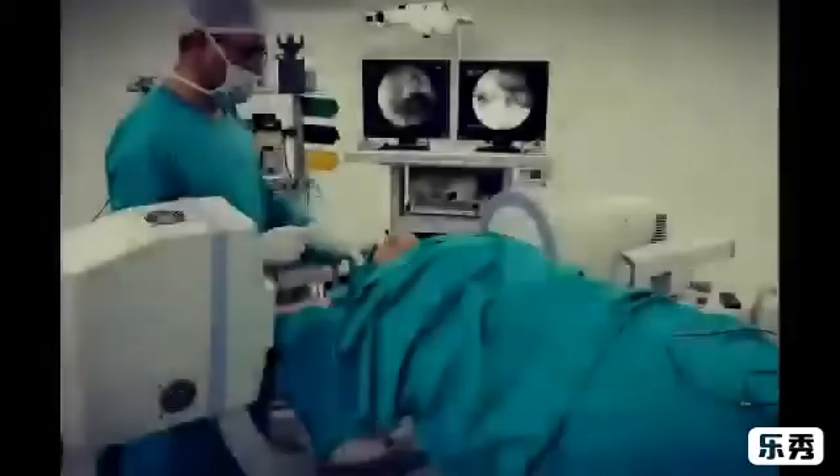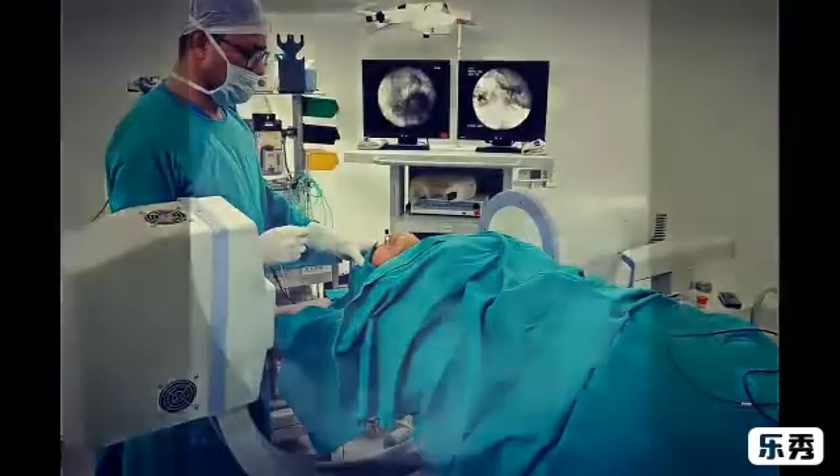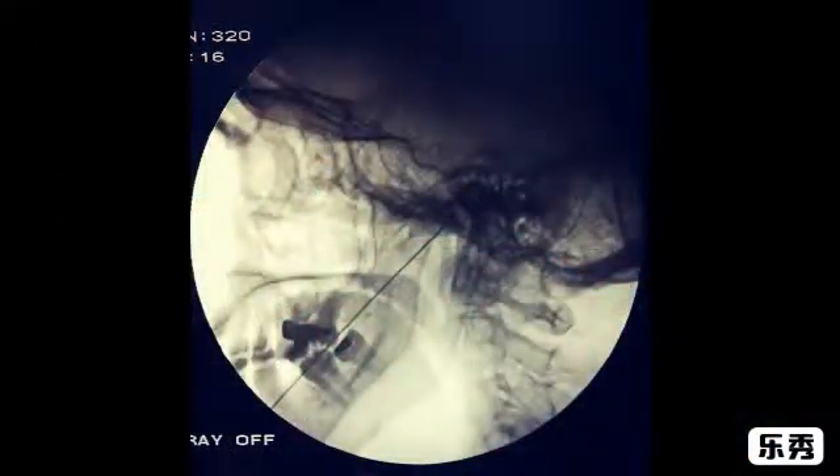If the target is the maxillary nerve, you have to go to the middle of the foramen. If it is the ophthalmic nerve, you have to go to the medial part of the foramen. On the lateral view, the needle is very close to the clivus.